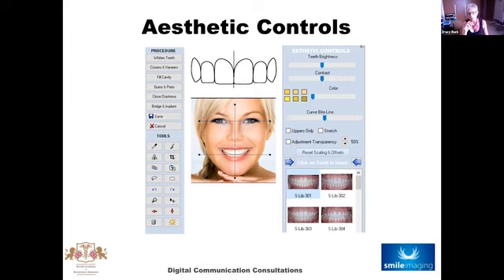We then have the curved bite line that you can see. So we can do the occlusal plane with that. If they've got the reverse smile or, you know, more smiley face, we can move the slider bar whichever way to make it match in with their existing smile. And then we have the color, contrast and teeth brightness. So we can get it exactly right if we're matching teeth into their existing smile. Or obviously, if they want a whiter smile, we can show that for them.